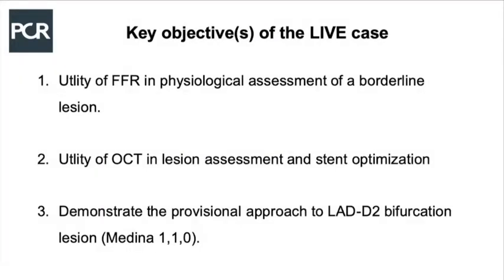So basically, we have to use the utility of FFR and physiological assessment of borderline lesions. And then we need to explore the utility of OCT in lesion assessment and stent optimization. And finally, we'll demonstrate the provisional stent approach to the LAD diagonal bifurcation lesion, Medina 110.